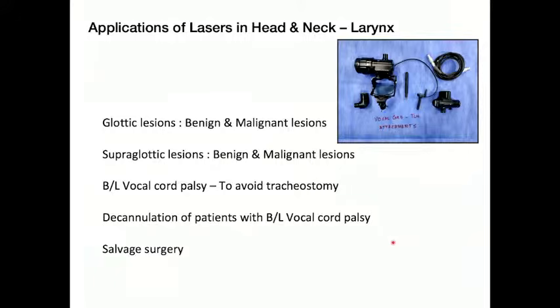But again, we need to slowly graduate from a very, very safe lesion, a benign lesion, to begin with, a leukoplakia next, a free edge vocal cord lesion next, maybe a T1A lesion well away from the anterior commissure. I think the first year of any transoral laser service should go along these lines. Benign lesion, leukoplakia, free edge T1 vocal cord lesion, and then once you have a very clear understanding, the entire set is kind of gelled in this thing, because you can see that there are so many places where things cannot go forward, right?